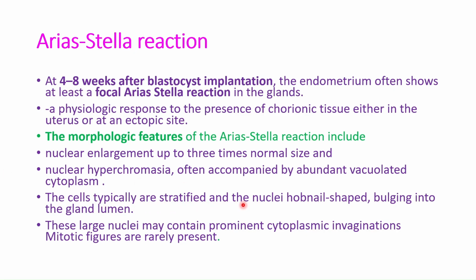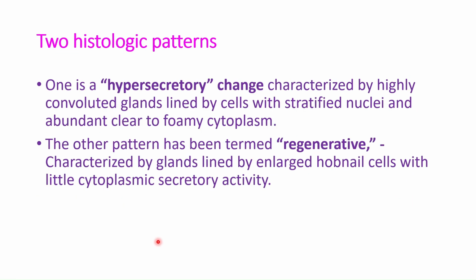Cells are stratified and nuclei show characteristic hobnail shape, bulging into the gland lumen, and the large nuclei may contain prominent cytoplasmic invaginations. Mitotic figures are rarely present.